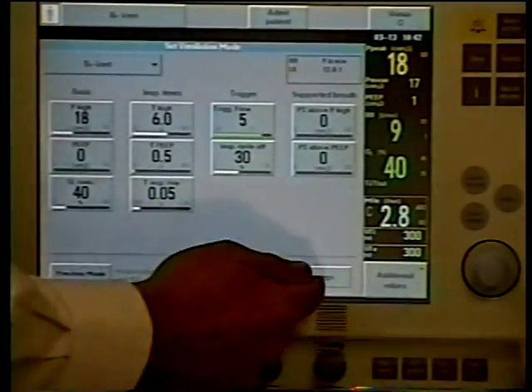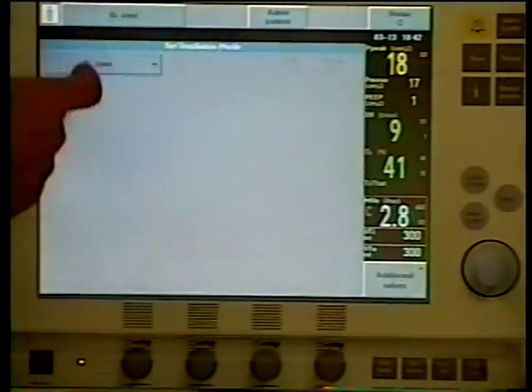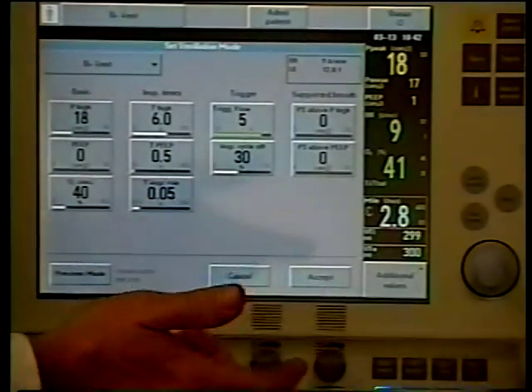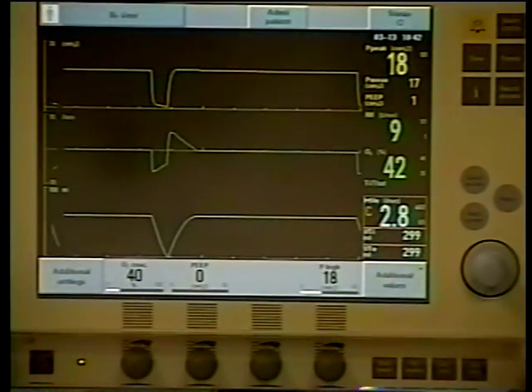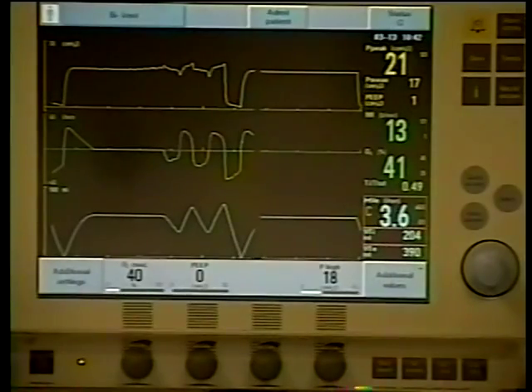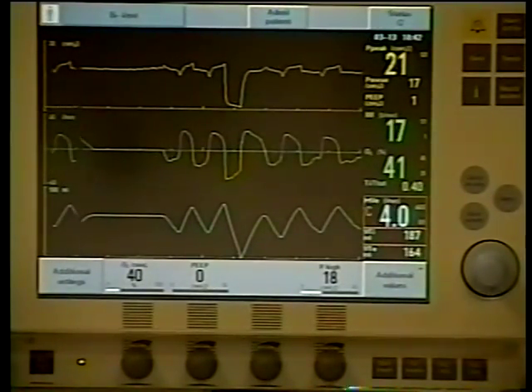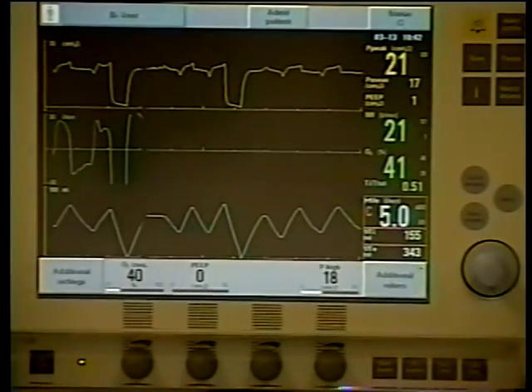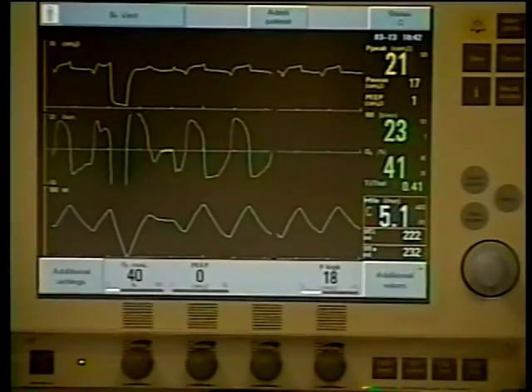The other thing to think about with respiratory rate: I go to a lot of places and I say, hey, you had this patient on Bivent yesterday and now they're not. Why? Well, the patient didn't do well. One of the number one reasons they say a patient didn't do well is that the patient was tachypneic. I hear that pretty routinely. Well, number one, a Bivent patient that's tachypneic is a good patient. I love tachypneic Bivent patients. The apneic Bivent patient is the one I don't like nearly as much.